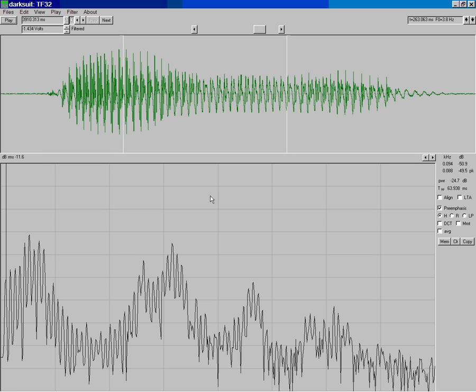Now, one of the problems associated with doing a measurement this way is that with each successive button push or by clicking and dragging, you sometimes can actually miss the peak because the resolution of the screen prevents you from being able to lay the cursor directly on the peak. And so as a result, this software has a really nice option that allows you to automatically find the peak.